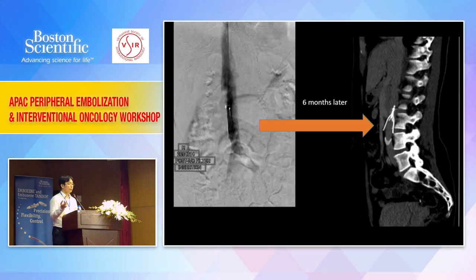So this is an example of this really young lady. You can see that we put in the IVC filter. It's in a relatively good position. You can see on the left-hand side that this patient has May-Thurner syndrome, right? Very clearly, you can see that there is a filling defect across the left common iliac vein.